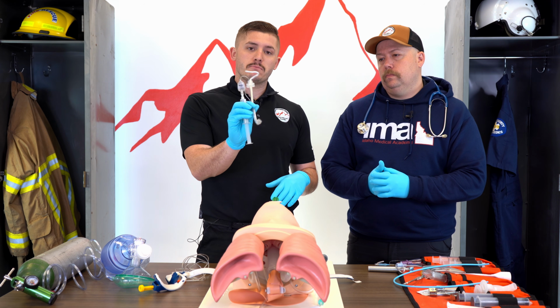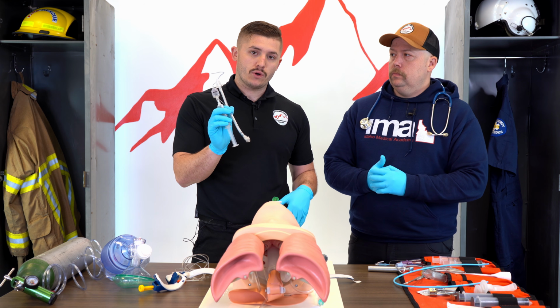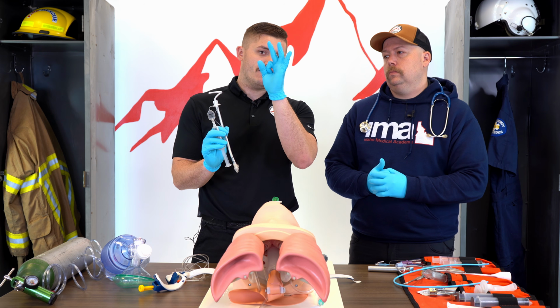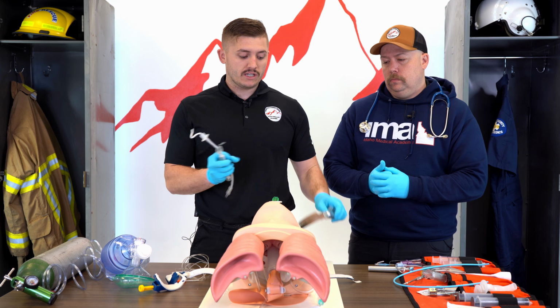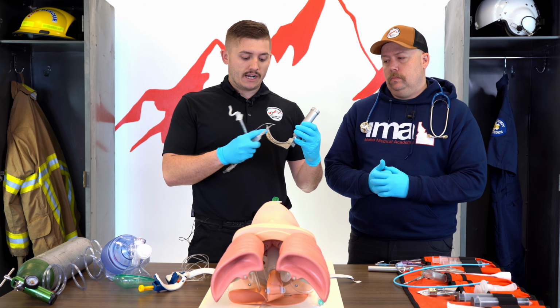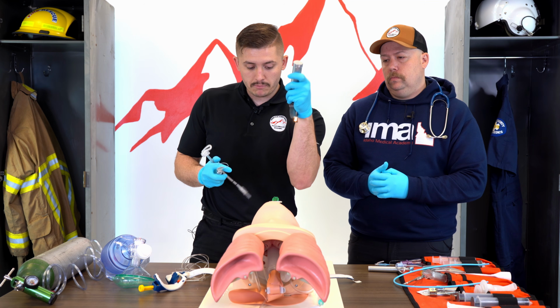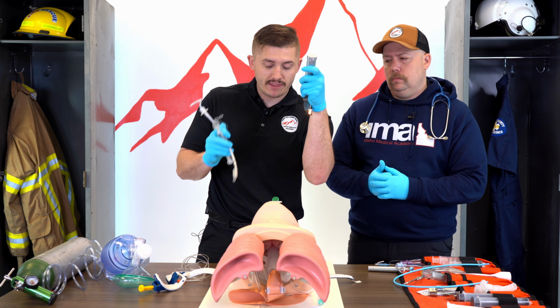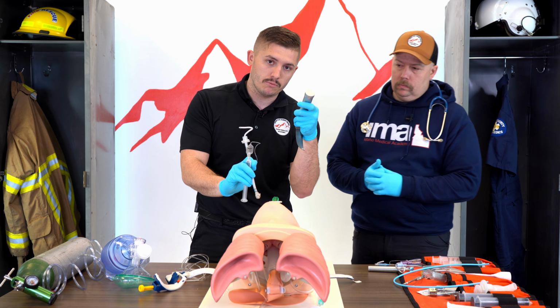As you see, it's much smaller than our LMA. This is going to go directly into the trachea. That trachea opening is very, very small. Chris is going to have to open the airway, use this, we call a blade. It's got a flashlight on the end. He's actually going to go into the airway, open and bring this lower airway up, find that tracheal opening, and place his tube inside of that tracheal opening.